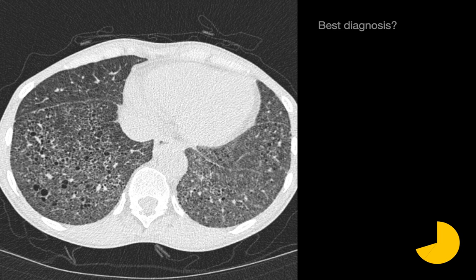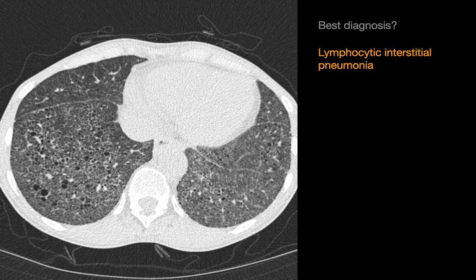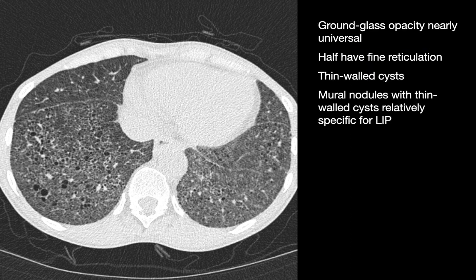What's your best diagnosis in this case? We see relatively diffuse ground glass opacities throughout the background of both lungs, lots of small thin-walled round cysts in the lungs, and a relatively diffuse reticular interstitial pattern. This combination of imaging features would be most likely encountered in the setting of lymphocytic interstitial pneumonia, or LIP. In LIP cases, ground glass opacities are nearly universal. Thin-walled cysts are the main feature, and about half of cases will exhibit fine reticulation. Mural nodules, when they occur along the walls of the air cysts, are a relatively specific feature for LIP.